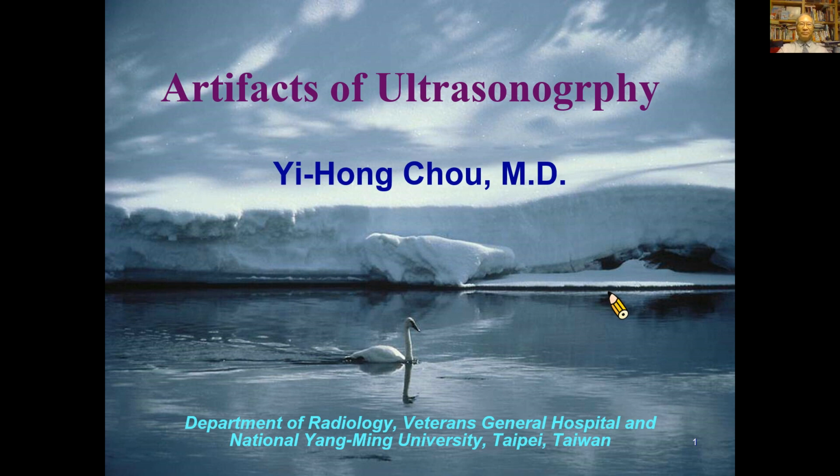My topic this morning is about artifacts of ultrasonography. As you can see here in the picture, there should be some artifacts. For example, here, an image on the surface of the lake is not real, so it should be an artifact. But the others here are real structures, for example, the swan.